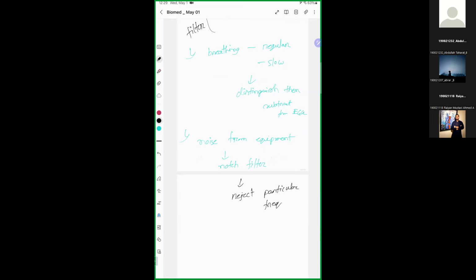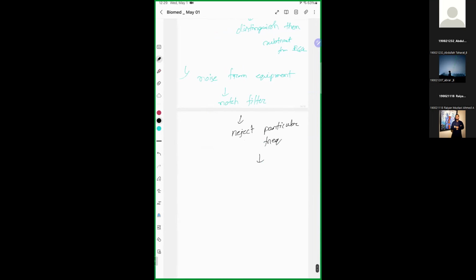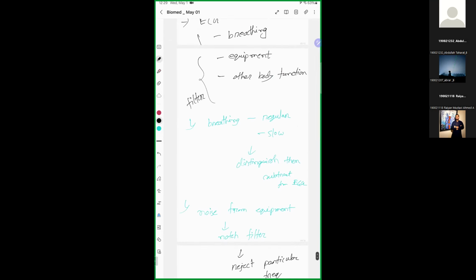At which frequency will we use it? The power line frequency. Any noise that comes into the input signal from the power line, you use a notch filter at that frequency, so all the frequencies related to it will be removed. These are the different filtering techniques you have to use to get your original signal out, a much purer signal.